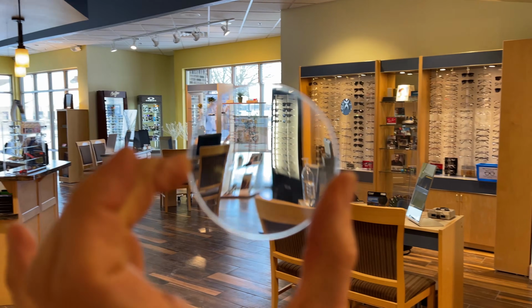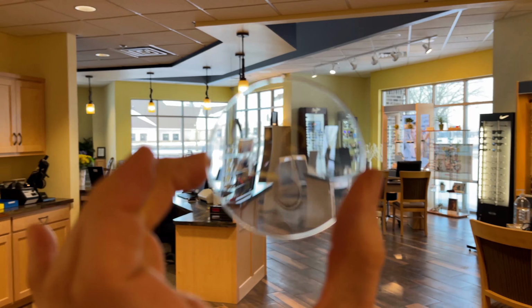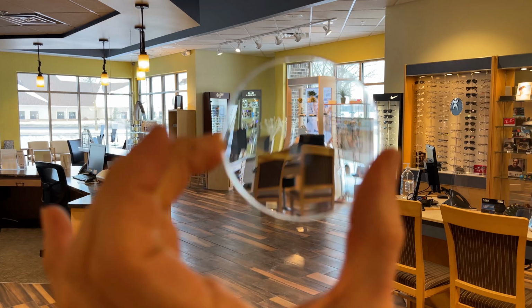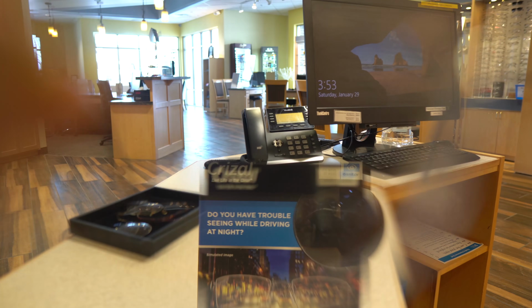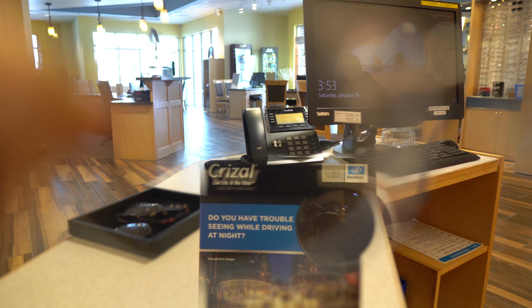And then from there, it's all about what distance you are looking at that object and knowing which part of the lens you need to adjust and look through. Now, assuming your glasses are put on and you're looking straight ahead into the distance, right where your eyes are set and to the top of the lens, everything should look good for the distance. But when reading up close, all the reading magnification is at the bottom of the lens. So if you tilt your head down like you normally would, you're still looking through the top portion of the lens, which is your distance, so things will seem out of focus.